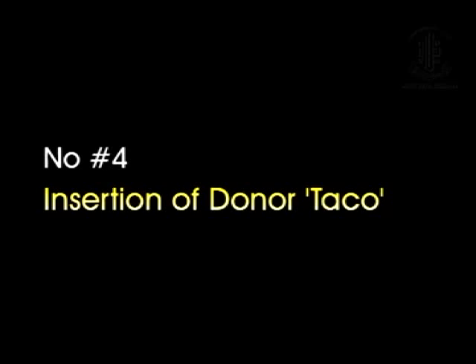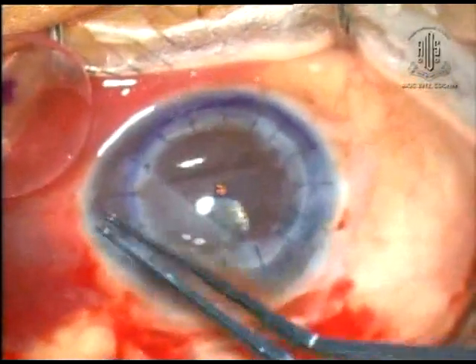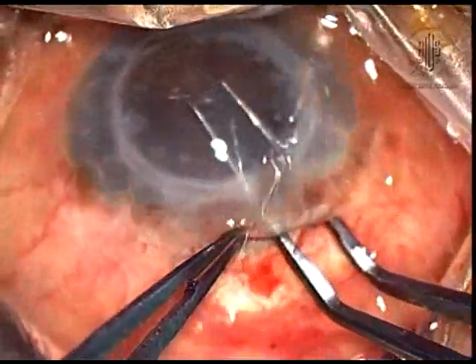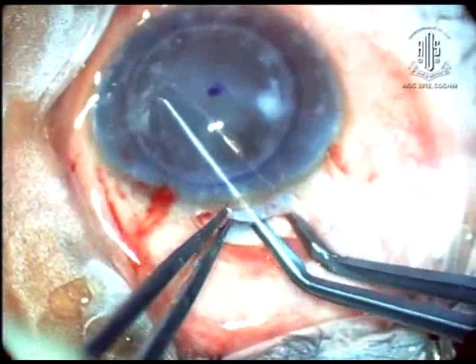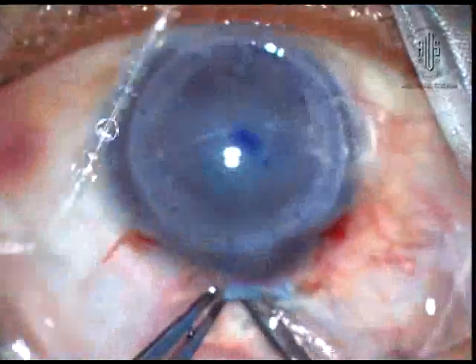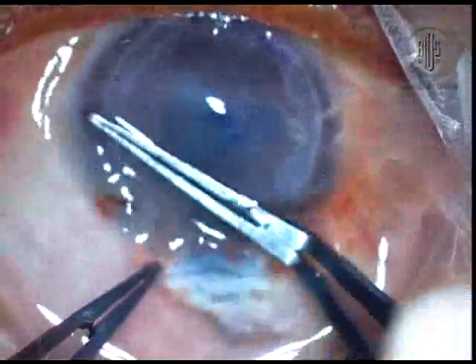Number 4. Insertion of taco. This is again a tricky situation. Because of previous PK, the scleral rigidity is lower in most of the cases, so the globe tends to collapse. Furthermore, the posterior ridge at the host graft junction may interfere with full entry of taco into the anterior chamber. This could be solved by gentle manipulation after BSS injection and tapping of the tissue from the surface.